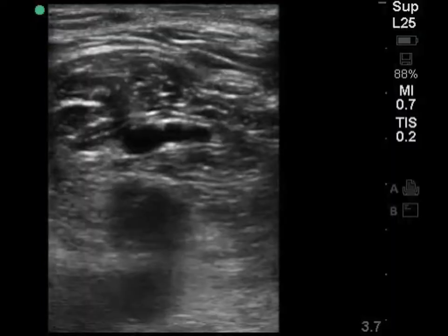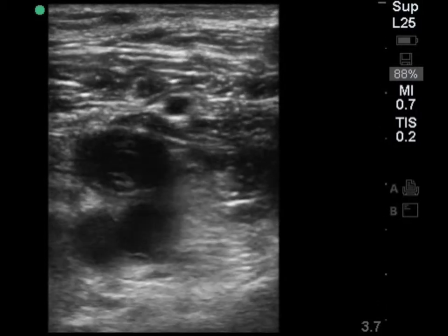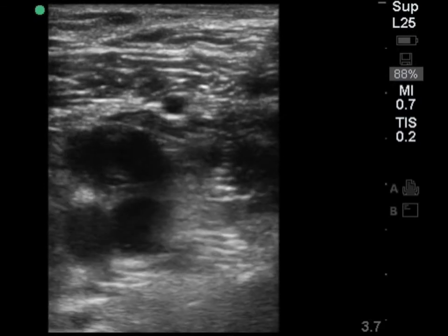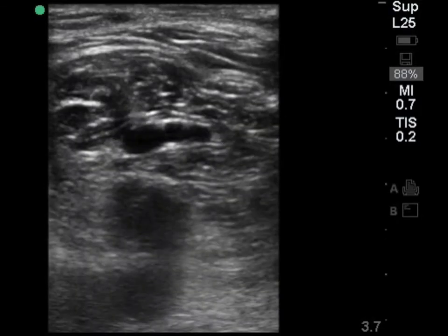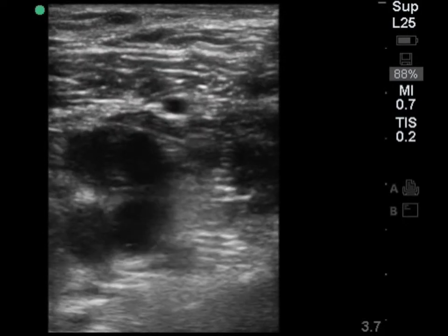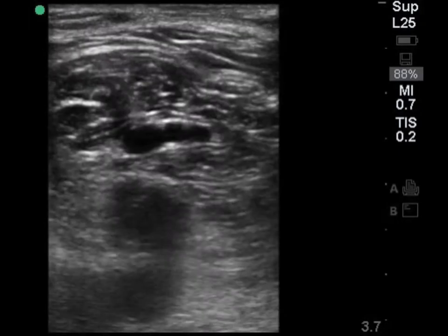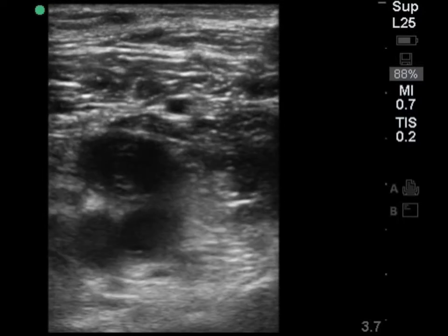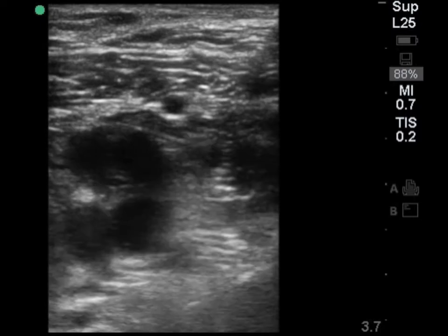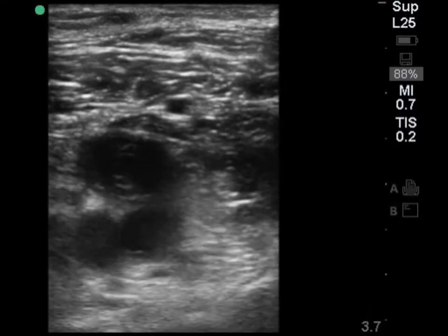This is another popliteal one. Ooh, tricky. What do you think here? Oh, I can see a small artery. That's pulsatile. Oh, and we have two veins, one vein on either side that are compressing. So is that positive or negative? Well, this one is actually positive. Those are superficial vessels that we're seeing. If you look a little deeper, you can see the big pulsatile popliteal artery, and superficial to it is a popliteal vein that is not compressing.